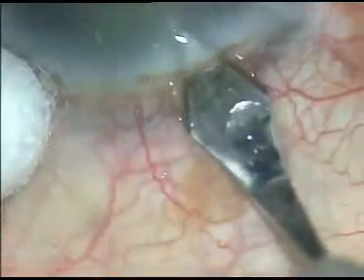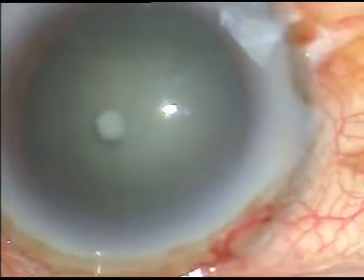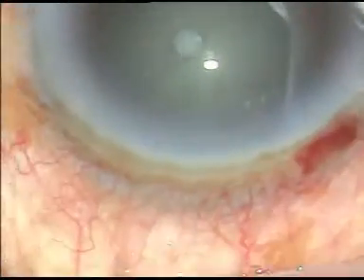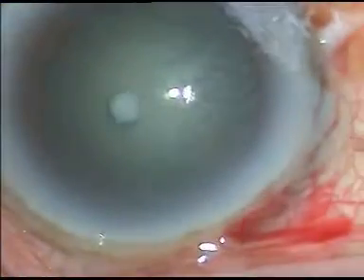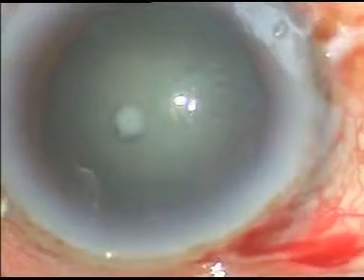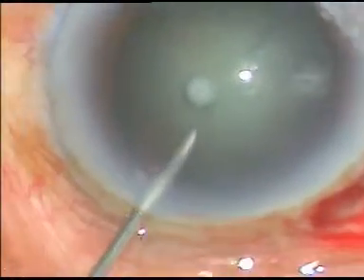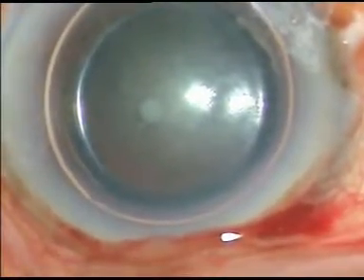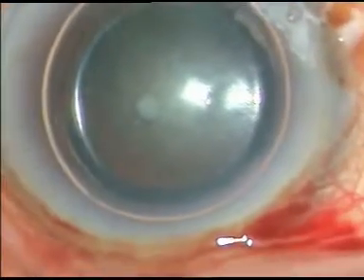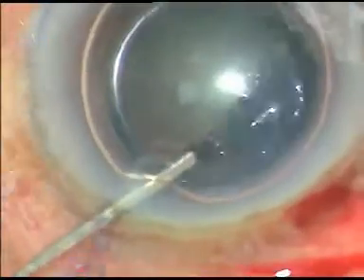In phacoemulsification surgery, the main incision is being given at 11 o'clock, and one side port is being made at 1 o'clock. Trypan blue dye will be used in this case. Before that, a big air bubble is injected into the anterior chamber — we do not want the dye to come in contact with the corneal endothelium. The dye is then used to stain the anterior capsule of the lens.